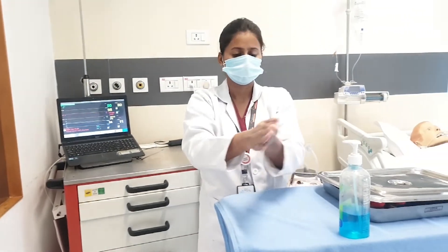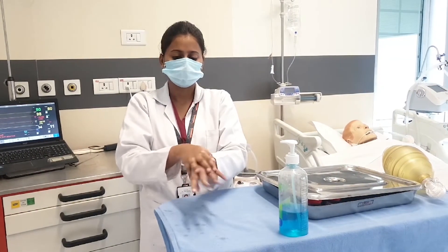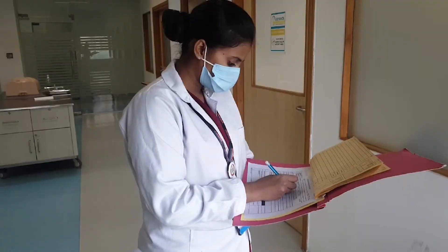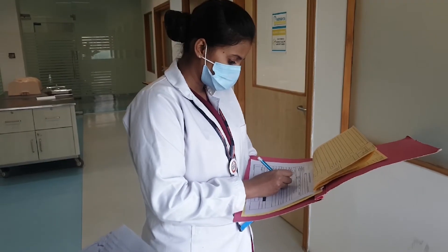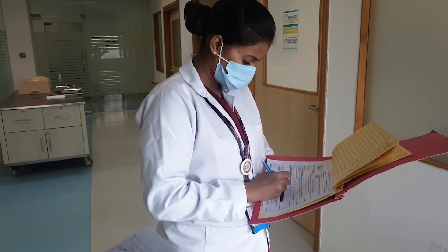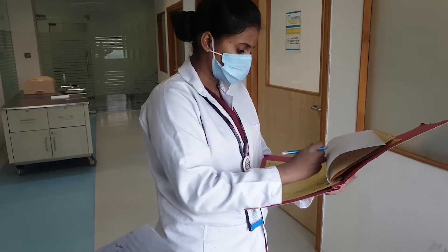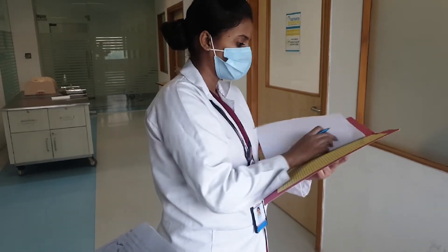Perform hand washing. Document the procedure in the Nurse's Notes and VAP Bundle Checklist, recording: amount, consistency, colour, odour, and client breathing status before and after the procedure.